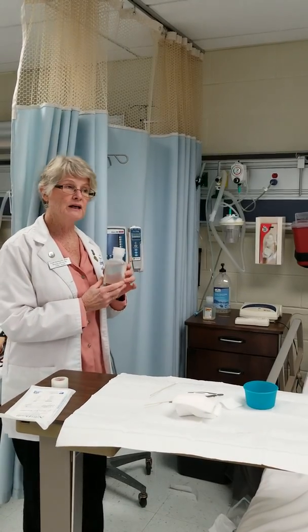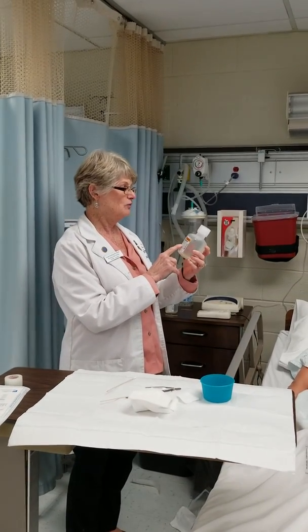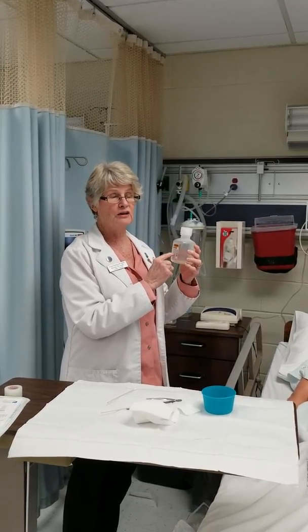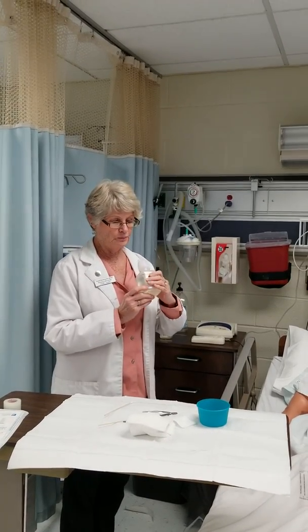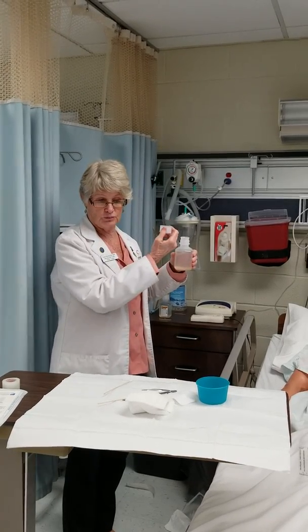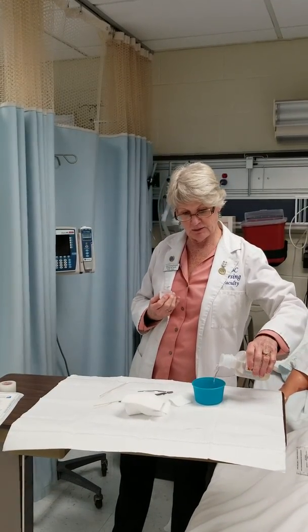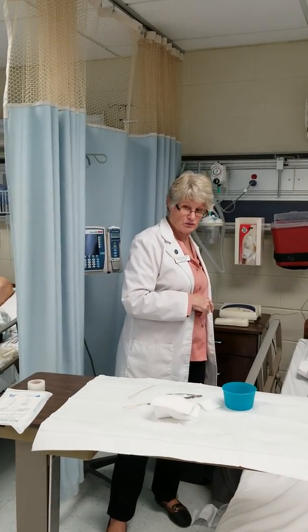Next, I will go ahead and put my sterile water into my cup that I'll use for cleaning the wound. I check it for date, time, and initials, it's good for 24 hours. If it's brand new, I will date, time, and initial at the time that I'm opening it. If it has been opened, I will cup my fingers over the label, unscrew the cap, lip it, which is basically just cleaning the bacteria off that side of the bottle, and then I can go in without reaching over my field and pour my saline into the cup. Then I put my lid back on and step back without turning my back on the field.